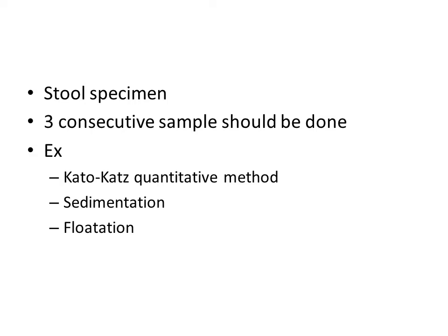So 3 consecutive means you have to collect a continuous 3-day sample.